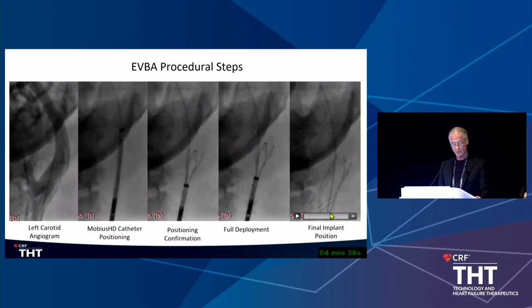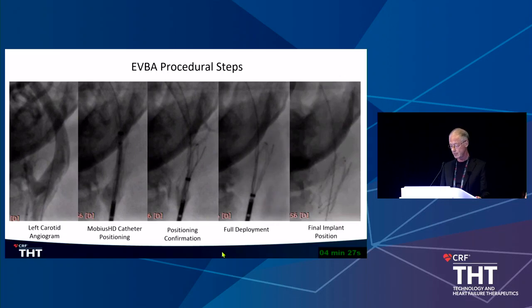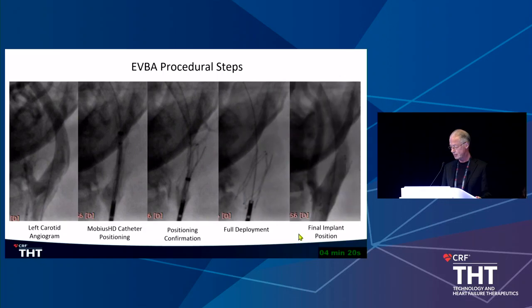This shows you a sequence of angiograms. This is the device in place. The distal part is deployed. At this stage it is fully retrievable, and only when you deploy the proximal part is it obviously not retrievable anymore. This shows you the final angiogram after release of the implant in the correct position.